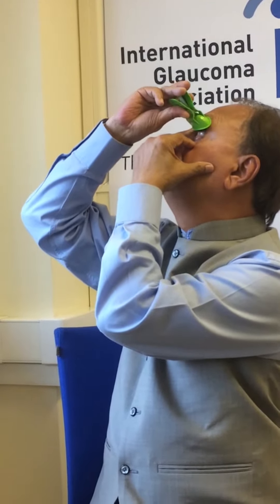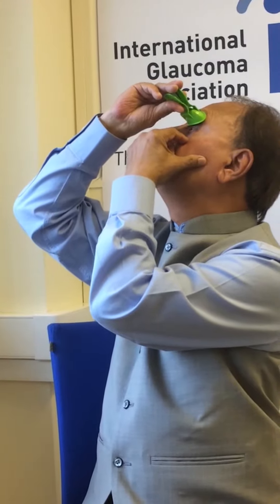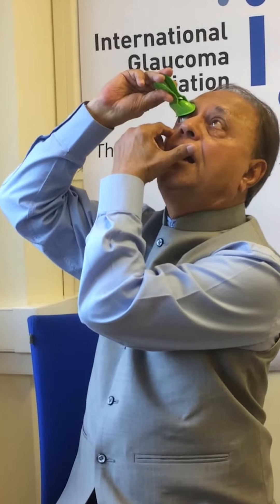Look into the hole, press gently, and the drop will fall exactly in the eye. Repeat for the other eye if necessary. It is as simple as that.